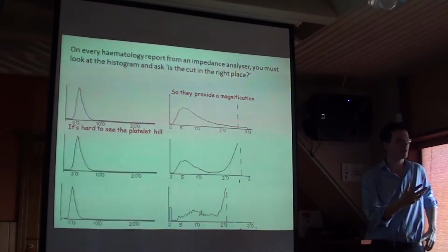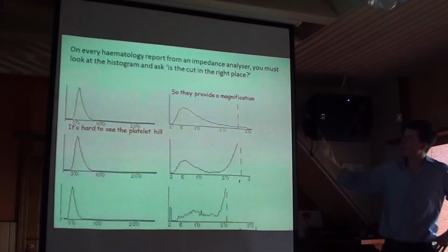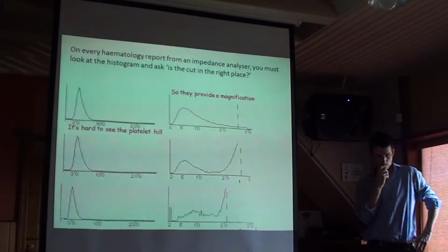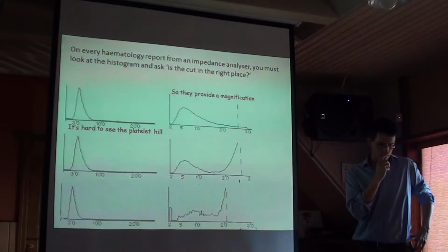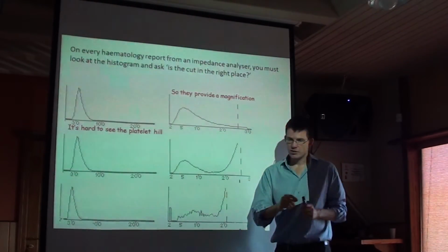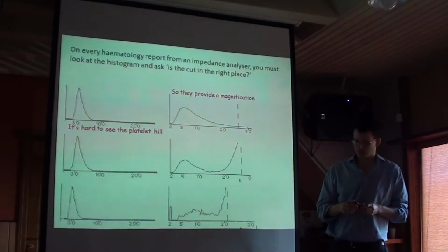So you're probably thinking, well, this is very distant and remote from what I do in day-to-day practice. But I want to show you some examples of typical impedance graphs that you'll see in general practice. See võib tunduda tavapraktiku jaoks ebaolulise jutuna, aga ta näitab konkreetseid näiteid, kus tegelikult on näha, kuidas see mõjutab tavapraktiku elu. So we are hoping to see two hills, one for the platelets and one for the red blood cells.